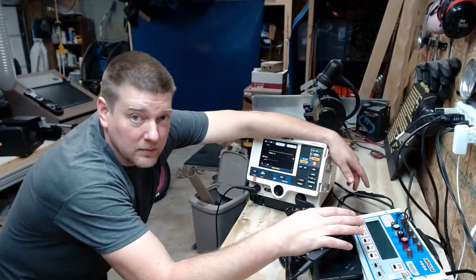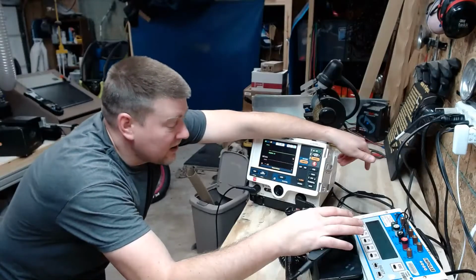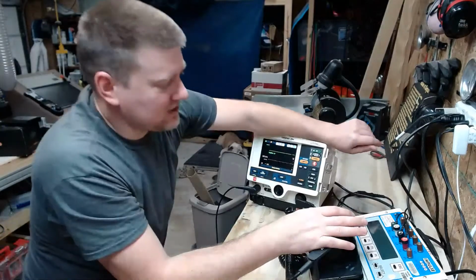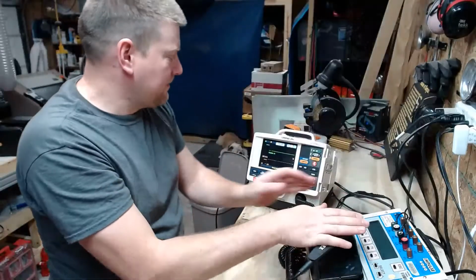That's crazy. I have never seen a biphasic defibrillator go that high. It's always monophasic. So more power to him, I guess. Oh, that's cooking a patient. That's a lot of energy. That's okay. We're going to test it out anyway.